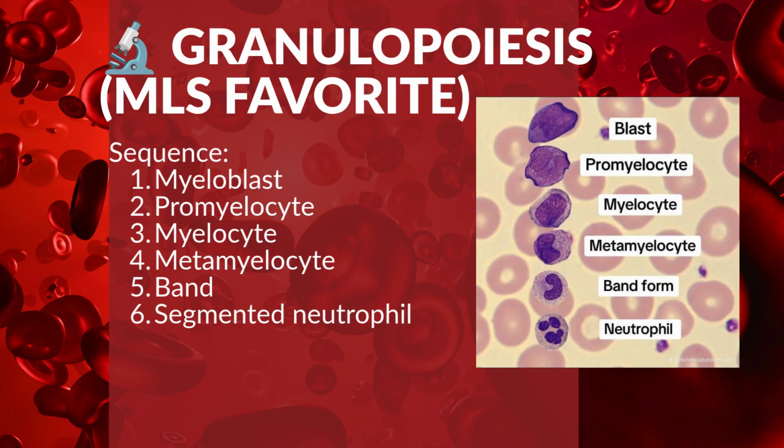Remember, the myelocyte is important. If y'all don't remember nothing else, this is the third stage of it. Important. Next is the metamyelocyte. My meta is pushing in. I'm pushing in because look at that. See how I'm pushed to the side, to the edge here? I'm about to become something, y'all.